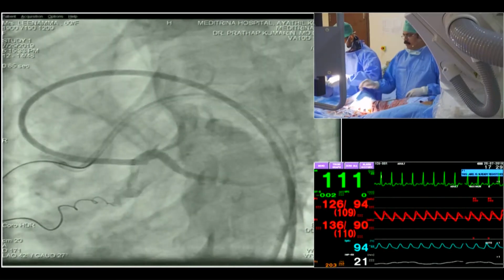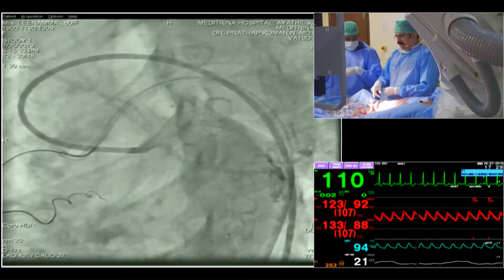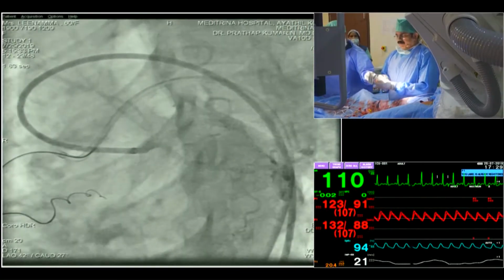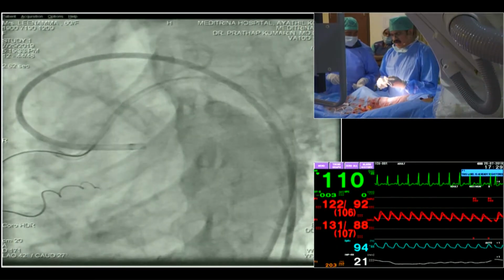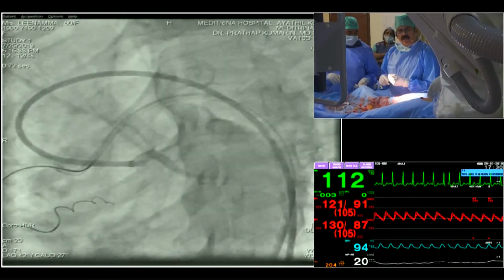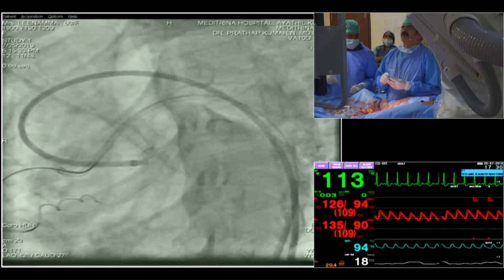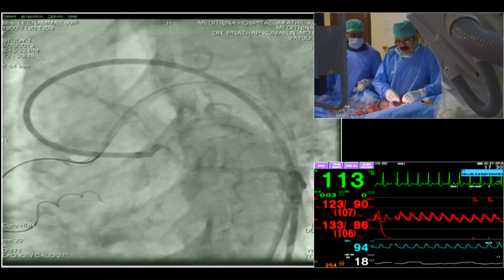What is the wire you are taking for antegrade? Now basically this is an ostial. Now antegrade I'm taking an XTR with a fine cross. The problem is actually this ostial CTO. You may lose it by just one pushing of the wire. So that is why I was thinking that it may be a real tough type, because you can see a small track there, but I don't know whether it will be easily going inside.